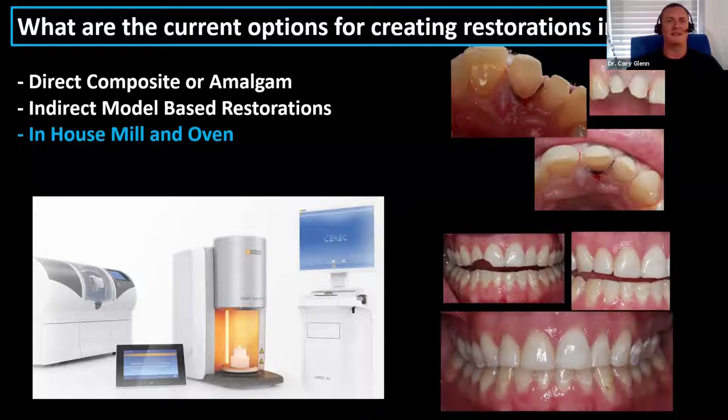And at $50,000, you've got something that, yes, you could do same-day dentistry, but you are also now basically a commercial lab. You can do almost anything that walks through the door except for a full arch titanium bar. And that's just because that's the next mill up that would be able to do that. It takes a lot stronger spindle.